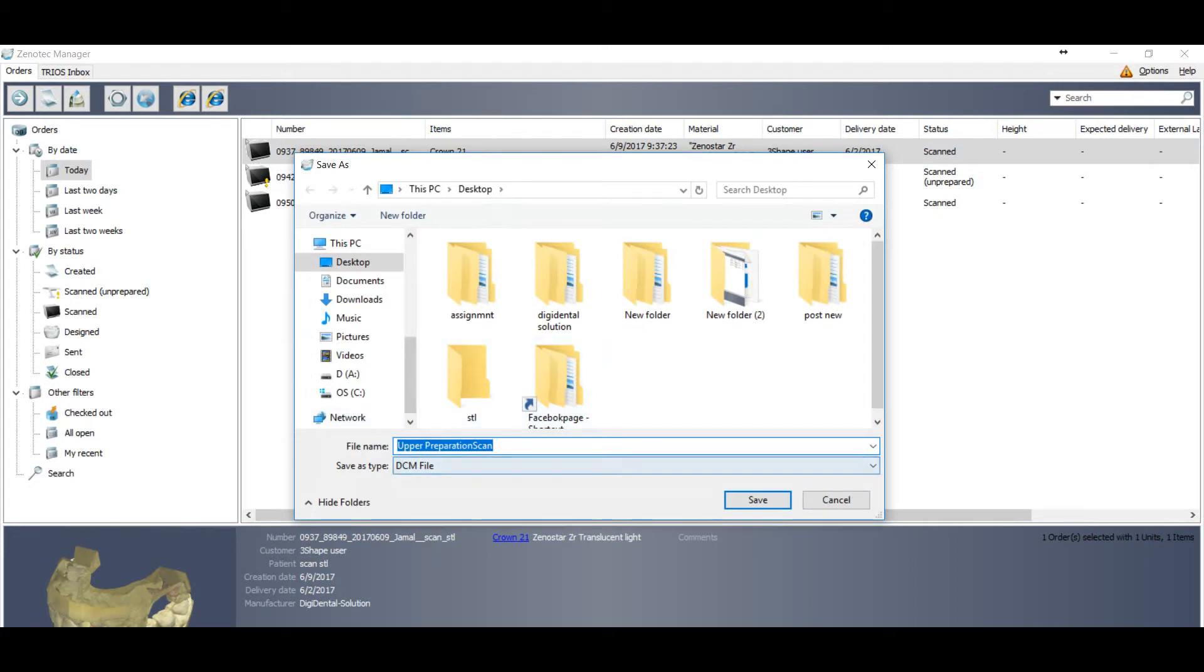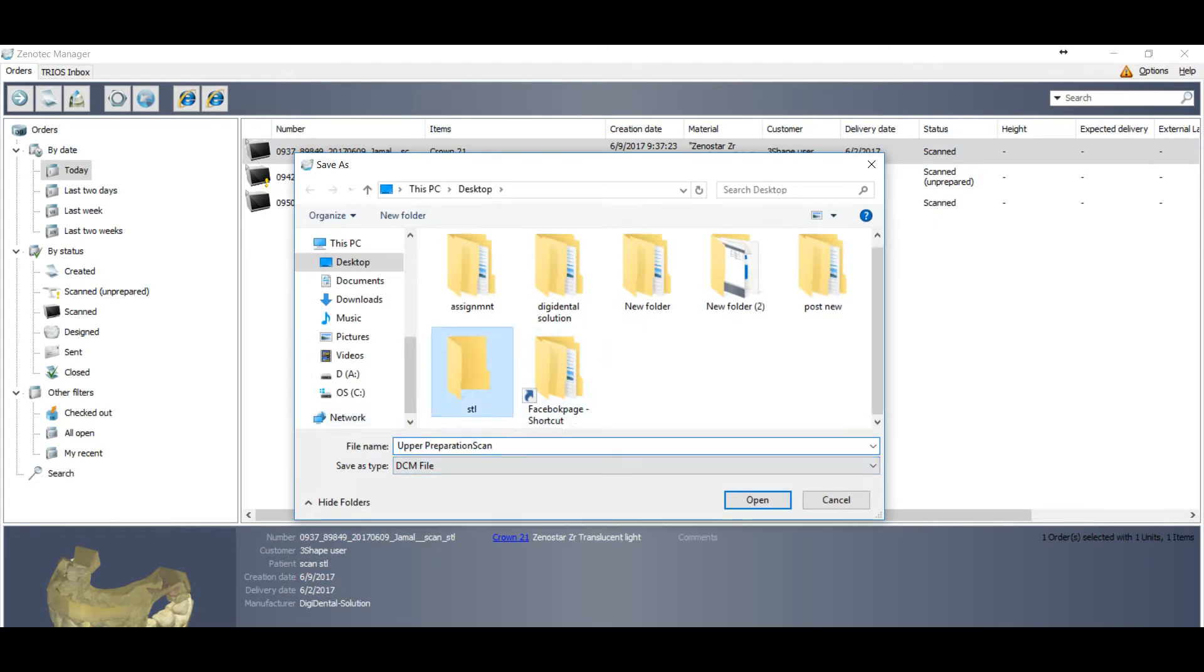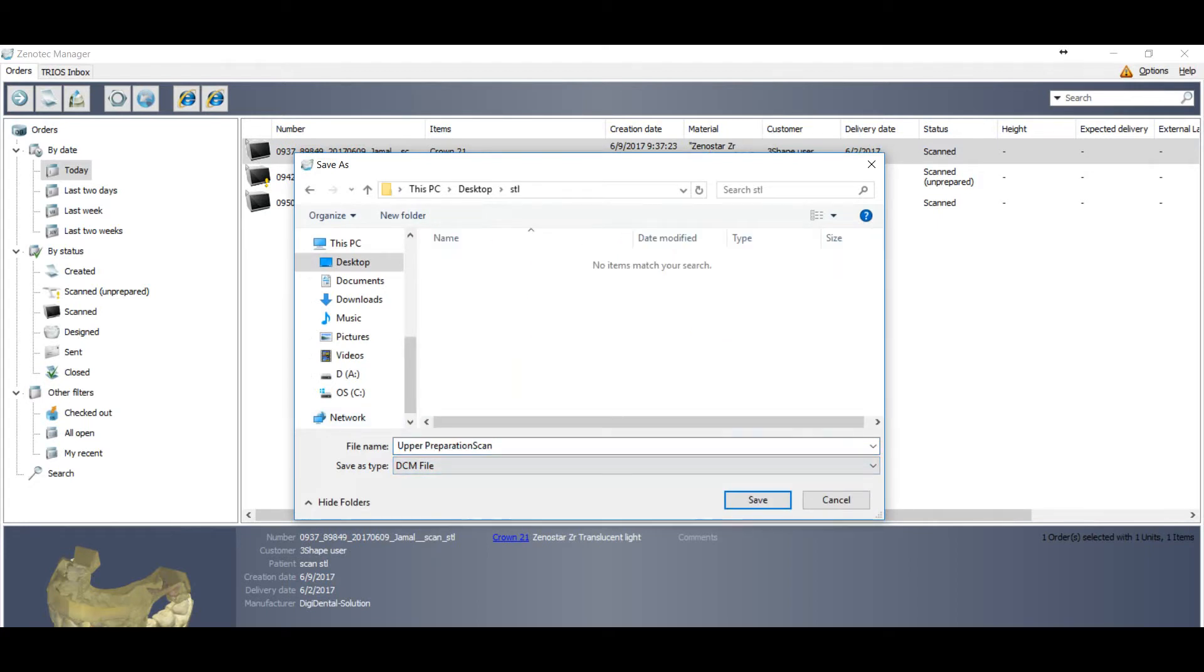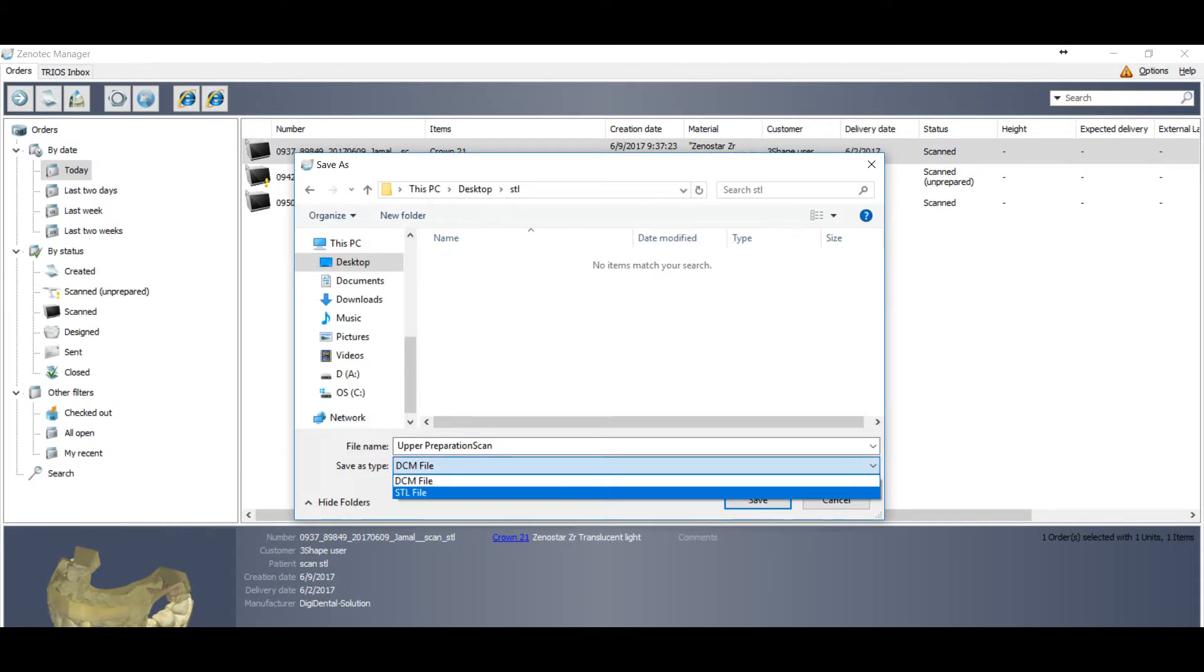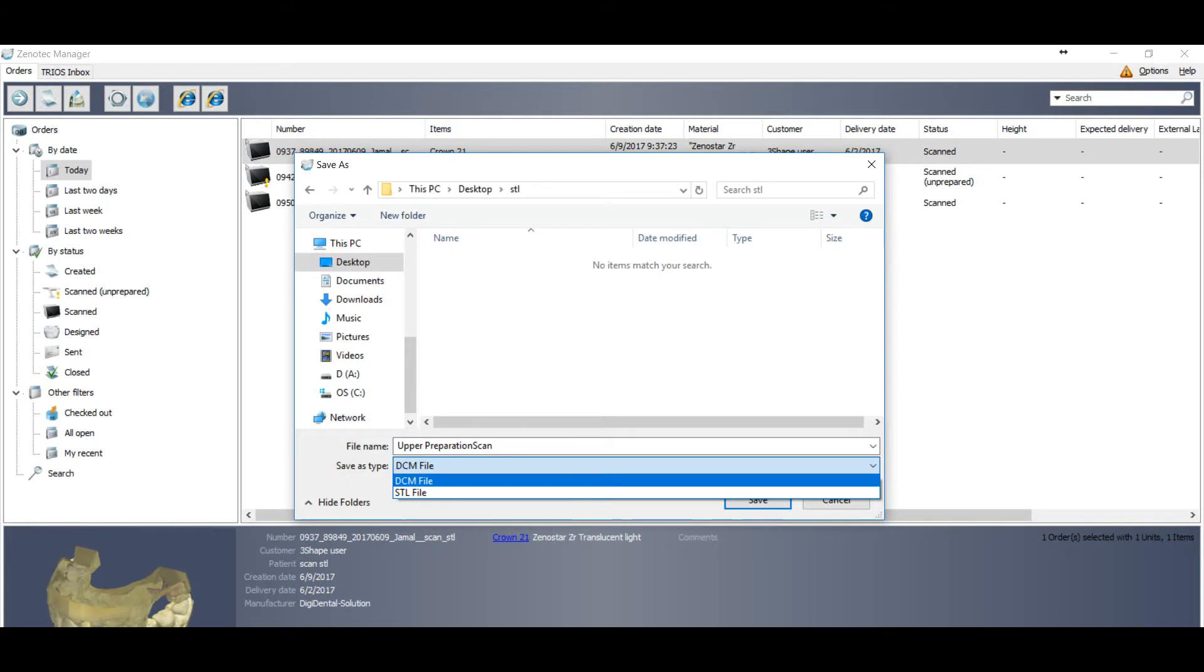And you will find a window for your folders. So you have upper preparation scan file name and save as type. Save as type you can select DCM and there is also option called STL.